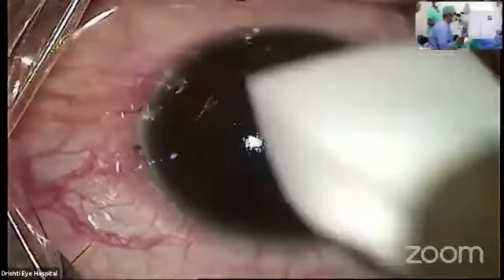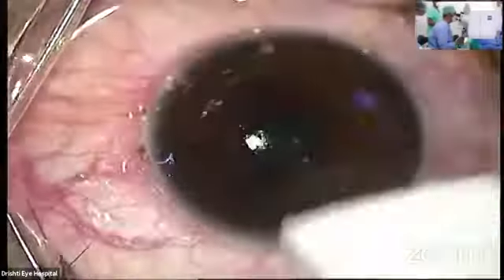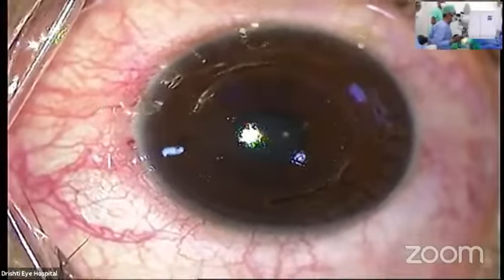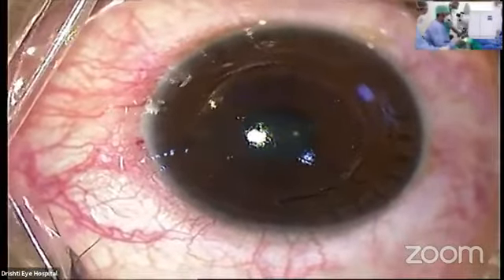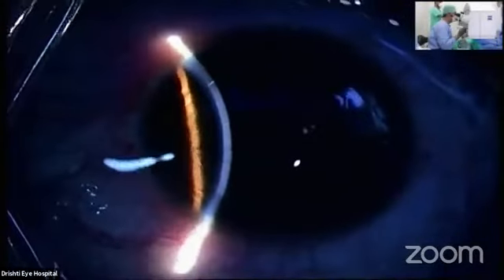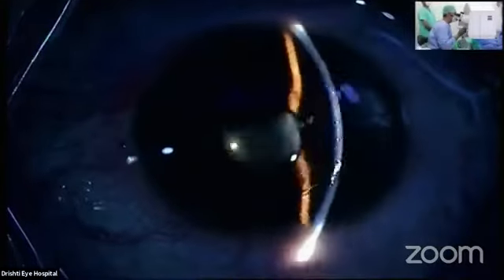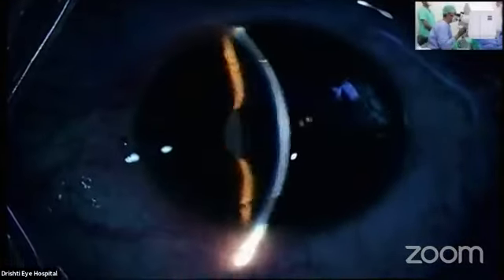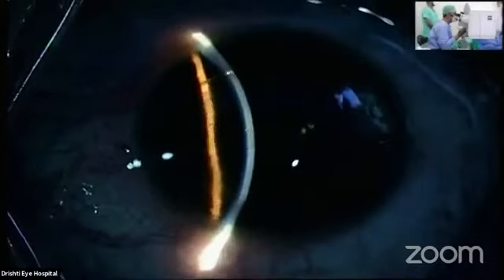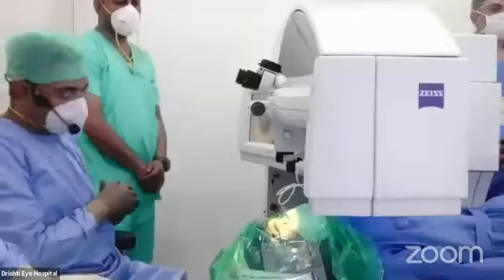With patients with high astigmatism, we use cyclotorsion control and we mark the axis as well. Dr. Sheetal can probably tell us a little bit more about it. I am only planning to show you one eye so that we can have some discussion. The procedure is now complete. We can use the slit to examine the interface for looking for any debris or to inspect. The Visumax has been very good for doing flaps as well, and we have been using this for SMILE for a good number of years now. The results are excellent and patient satisfaction is very good. I will be happy to answer any questions.